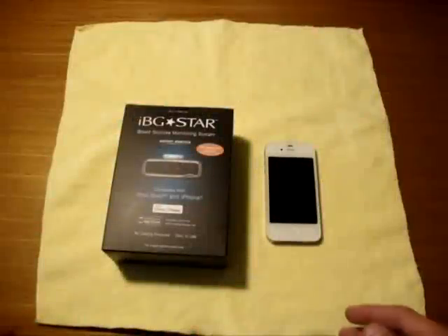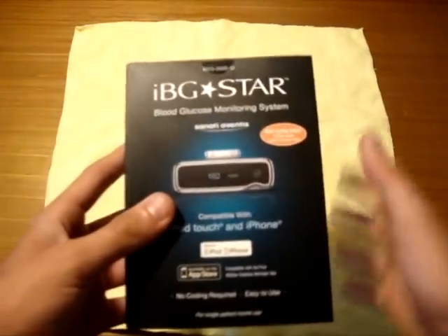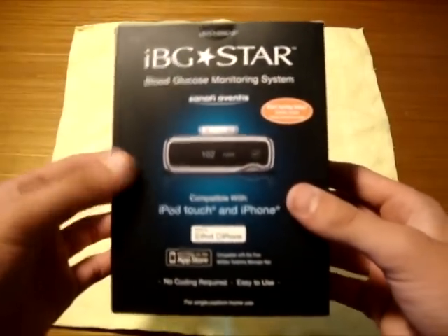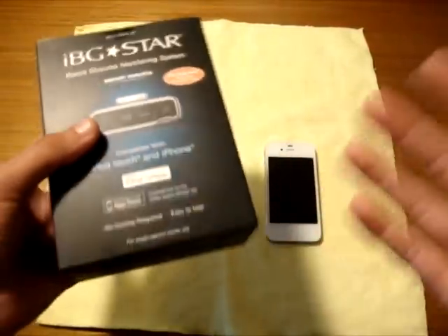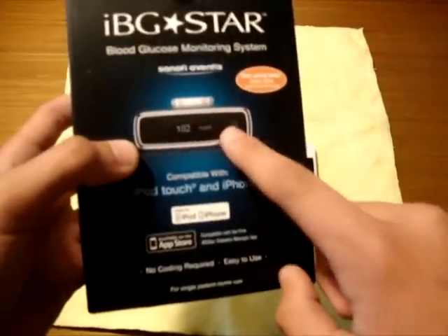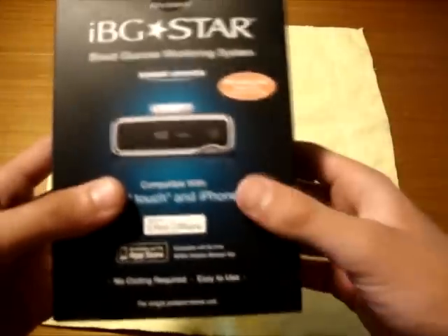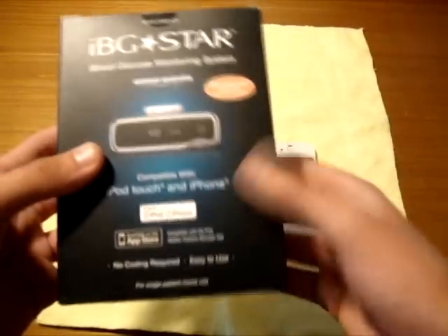I'm super excited about this product. The IBG Star is a very revolutionary product for type 1 diabetics such as myself. I've been a type 1 diabetic for the past 14 or 15 years. Type 1 diabetics have to test their blood sugar 6 times a day — poking a finger or toe to extract blood and put it onto a testing strip which plugs into this device, which tells you what your blood sugar is. If it's too high or too low, you take action — medicine or sugar intake.